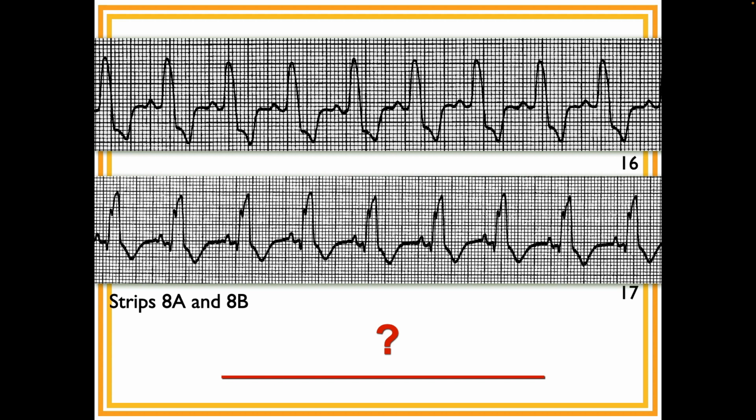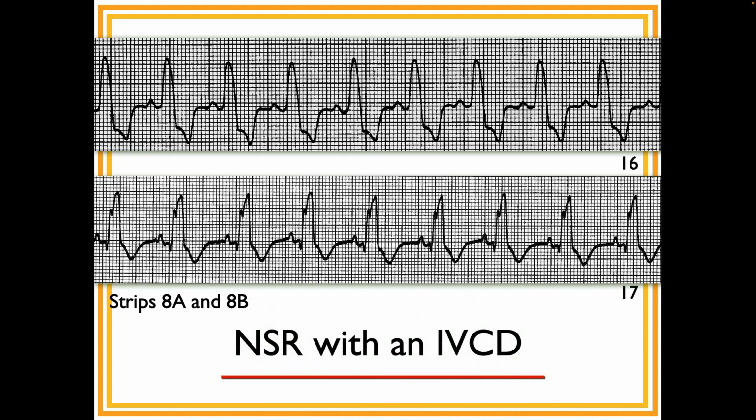Okay, Andrew, what are these strips here? Looks like normal sinus rhythm with an IVCD. Yep. The bottom one's, keep that. I'm sorry, what was that? Well, the bottom one looks more like those rabbit ears. Yeah, it does. So, just kind of a little bit of common sense.